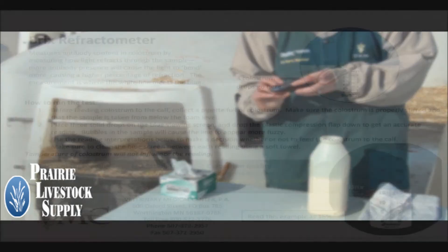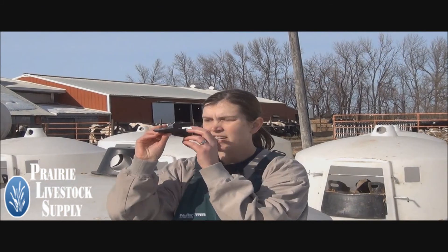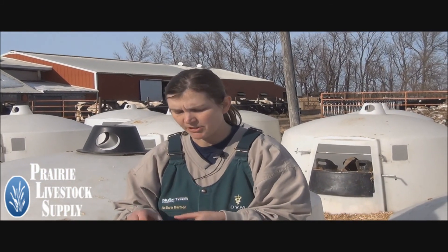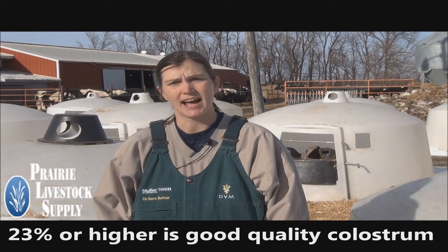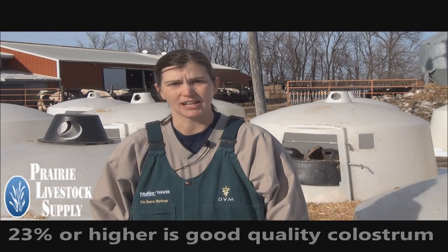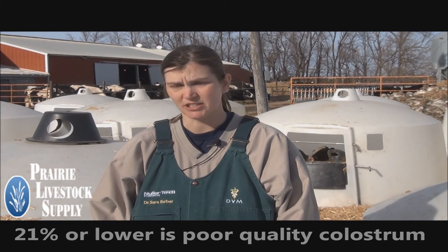Open the flap on the refractometer and place three drops of colostrum on the screen. Close the flap and hold it up to the light. You will see a blue line on the refractometer which correlates with the percent of light refraction. If it reads 23% or higher, there's a high level of antibodies and this is good quality colostrum. If it reads 21% or lower, it's poor quality colostrum and should be discarded.